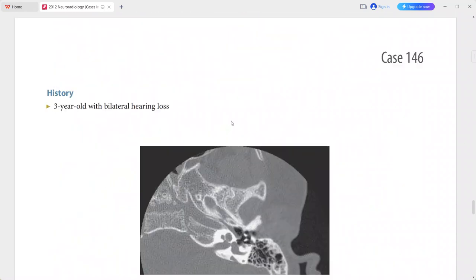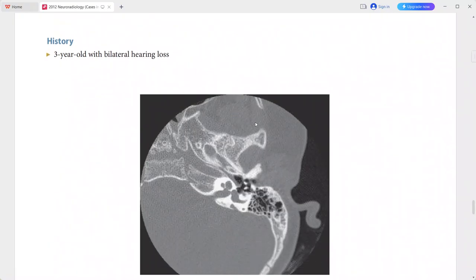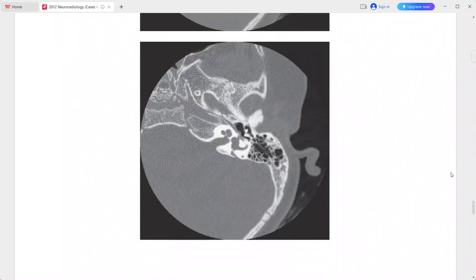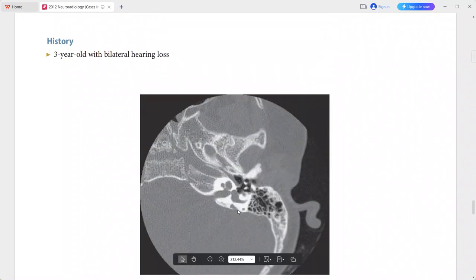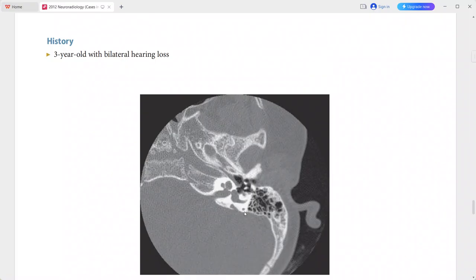Next is a three-year-old child presenting with bilateral hearing loss. The vestibular aqueduct appears enlarged. The cochlea has an abnormal shape with a bulbous appearance to the apical turn.